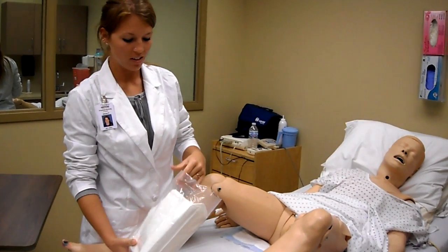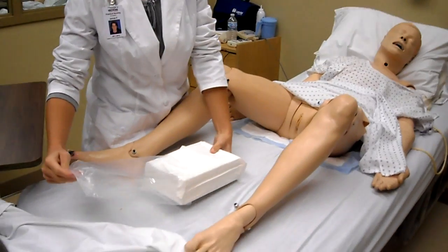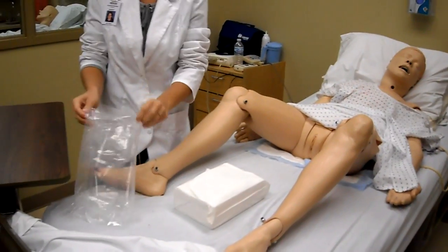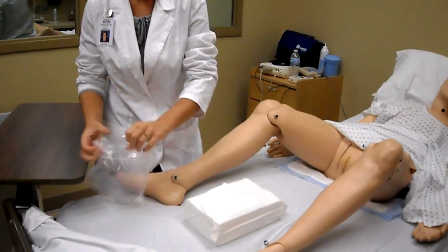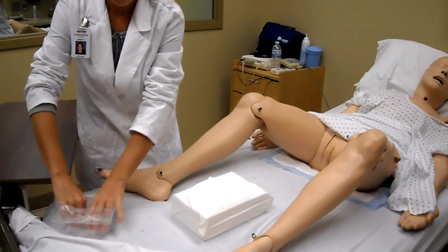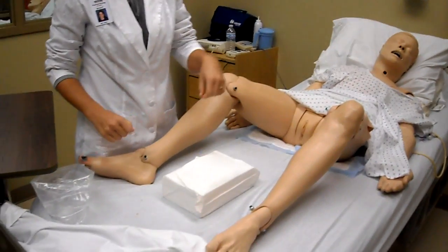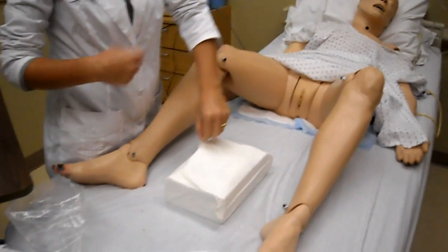This is Foley catheter insertion. You're going to take your sterile field out of the package and use your package as a guard. Then you're going to open up your sterile field, taking the farthest part away from you.